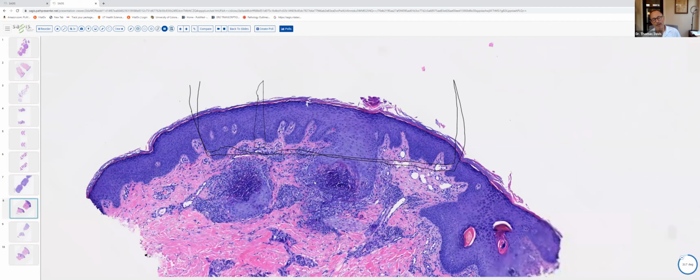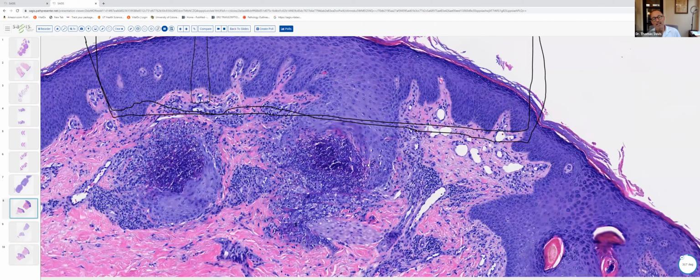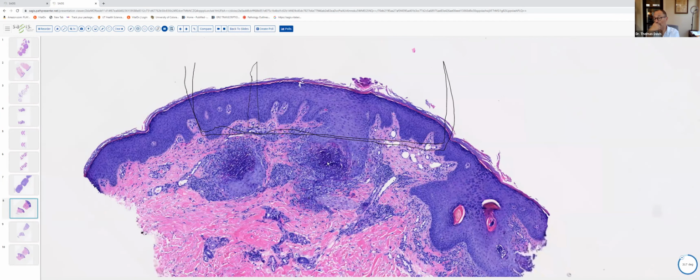What's characteristic about EPS, or elastosis perforans serpiginosa, is again a narrow cup-shaped channel, resembling somewhat a vacuum cleaner, and it's sucking up these refractile elastic fibers. One could also consider the diagnosis of a perforating variant of periumbilical pseudoxanthoma elasticum, PXE.